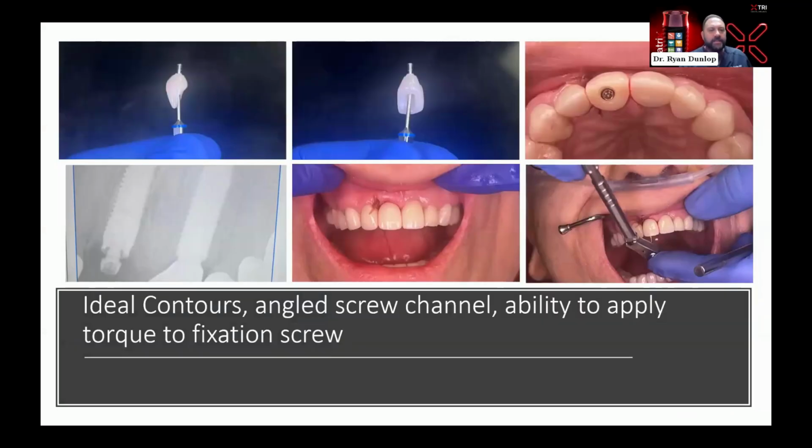And we designed a single unit crown that had an angled screw channel. This screw channel would have come through right at the incisal edge of the facial if we didn't angle it. So I'm certainly glad that we did. So I was able to screw this right into the mouth. You can see there's no tie base, there's no abutment, there's no pickup in the mouth. This is all done digitally. And I was able to exactly copy his previous crown.